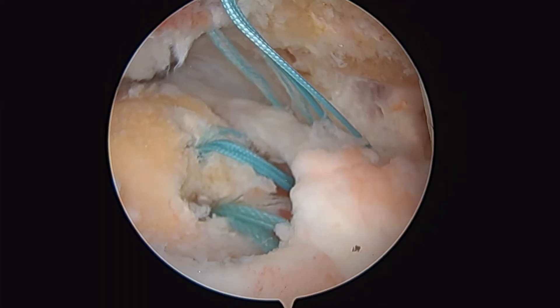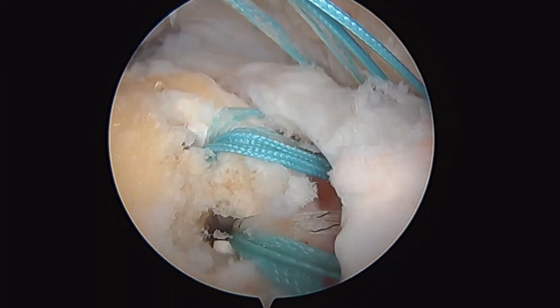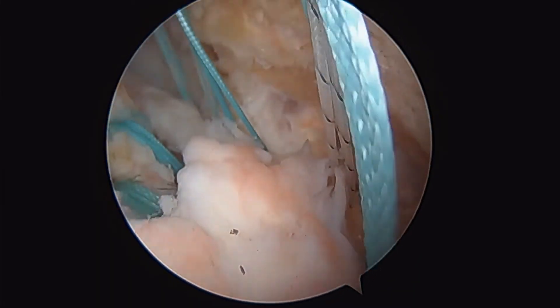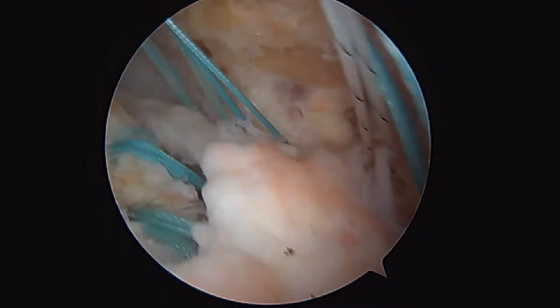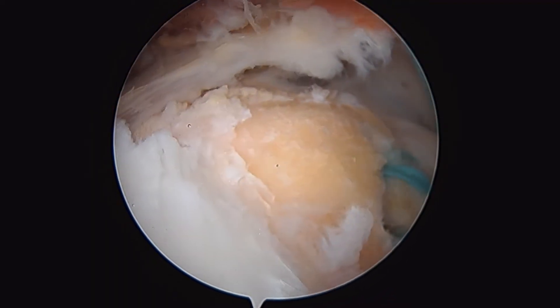Now I'll show you what we've done here. These are double loaded anchors — there you can see the posterior and anterior ones. We've passed four horizontal mattress sutures through the cuff. So we go blue, white, blue, and then blue and white there, slowly working our way from the back to the front. And now what we're going to do is bring them out here for a knotless double row repair.